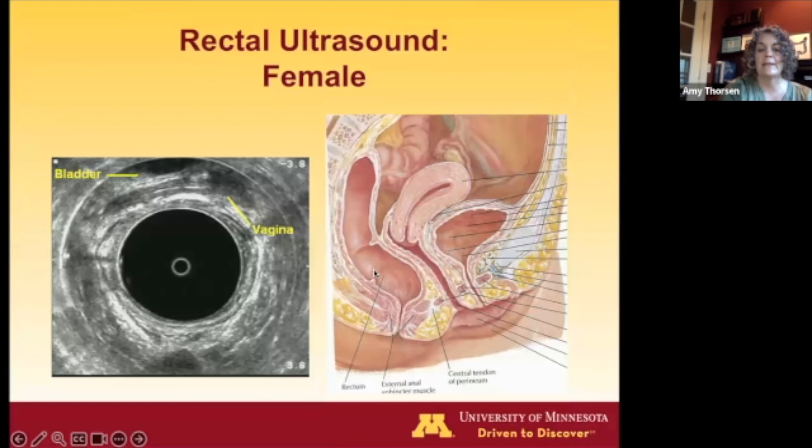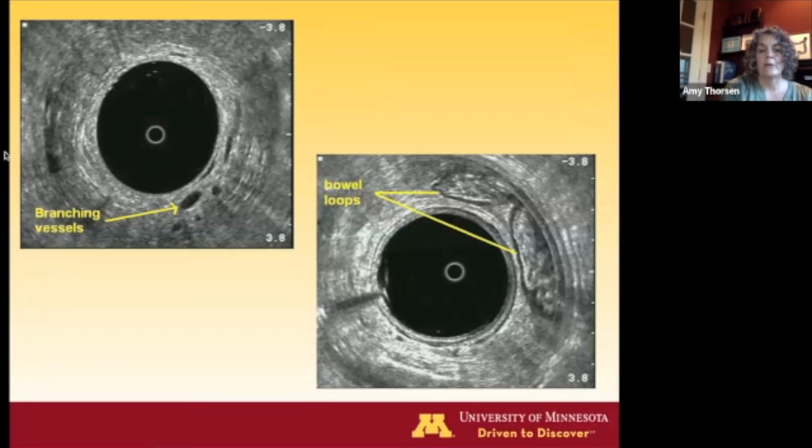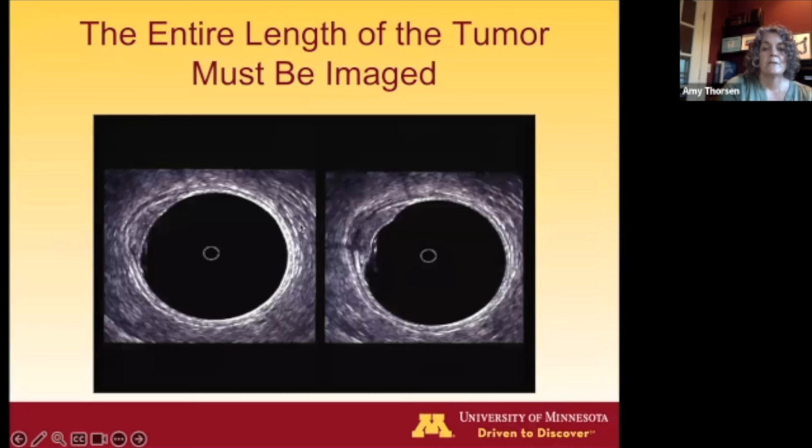On a female view, you can see the rectum, vagina, and bladder. You can see the white of air in the vaginal lumen and the hypoechoic fluid of the bladder. Branching vessels look different from lymph nodes because they have very similar echogenicity to the water in the balloon. You can see loops of bowel in the intraperitoneal rectum, and can tell whether your lesion is intraperitoneal or extraperitoneal, which matters for TEM or TAMIS planning.